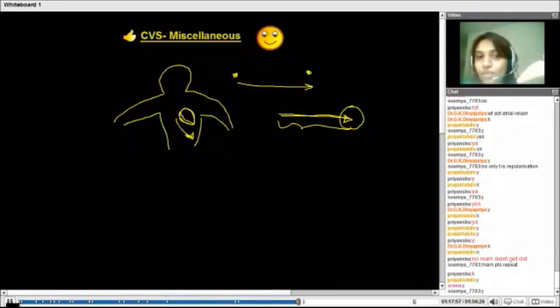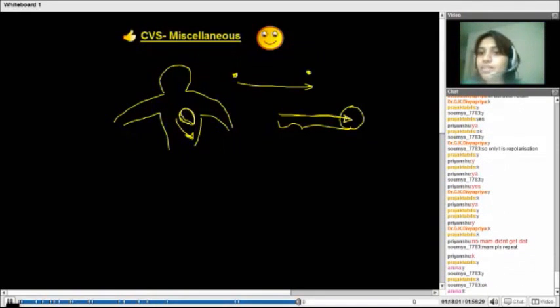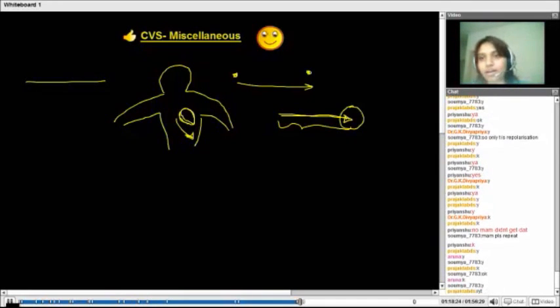Right? So when we consider the heart, we are doing the same thing. In the heart again, there is a particular direction where the flow of current is taking place. So we have to define what the horizontal is in the heart. Whenever we make an angle, we make it in relation to a certain horizontal, isn't it? In a normal scenario, when we consider horizontal, we consider the ground or earth as horizontal, right?